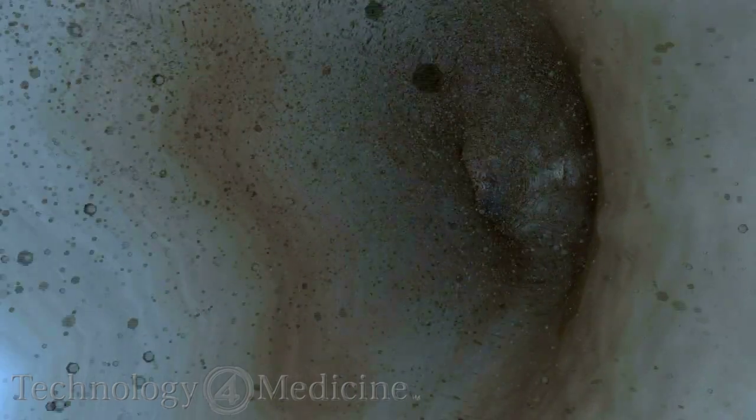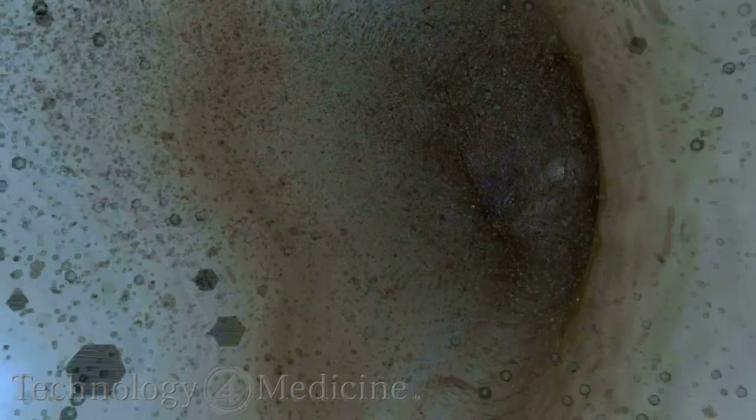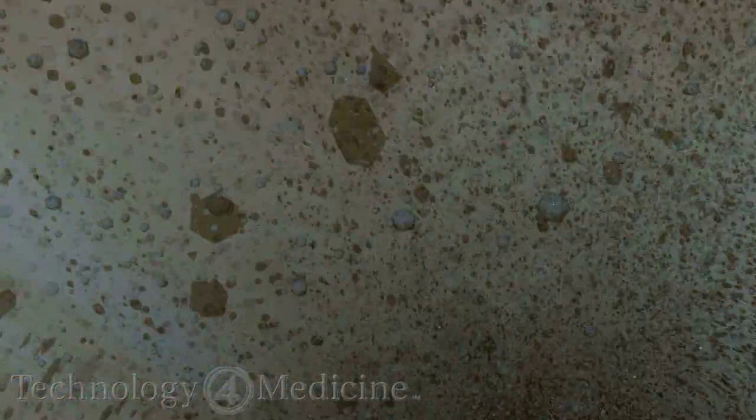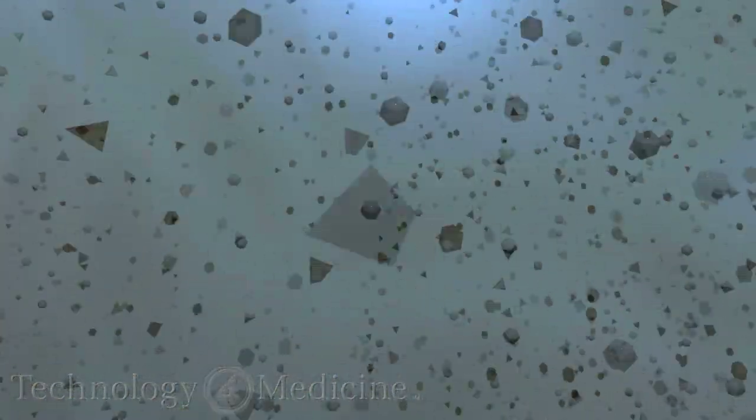flushing of smear layer and debris can be seen exiting upward from the canal into the access opening in the coronal aspect of the tooth. This action has been demonstrated in both experimental test models and clinical trials during the irrigation portion of treatment.